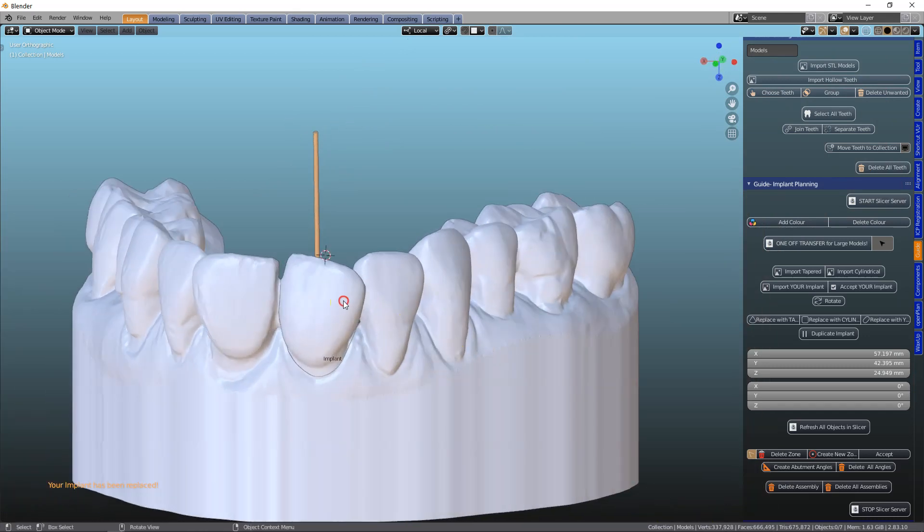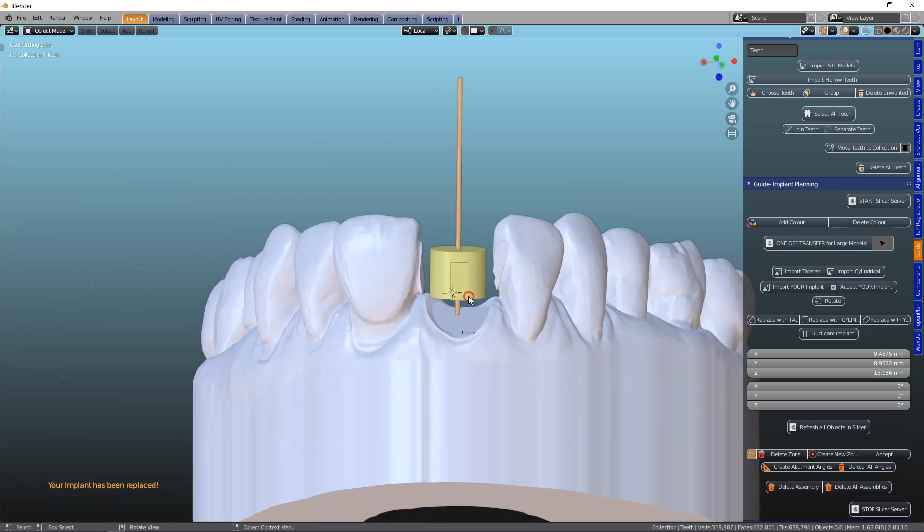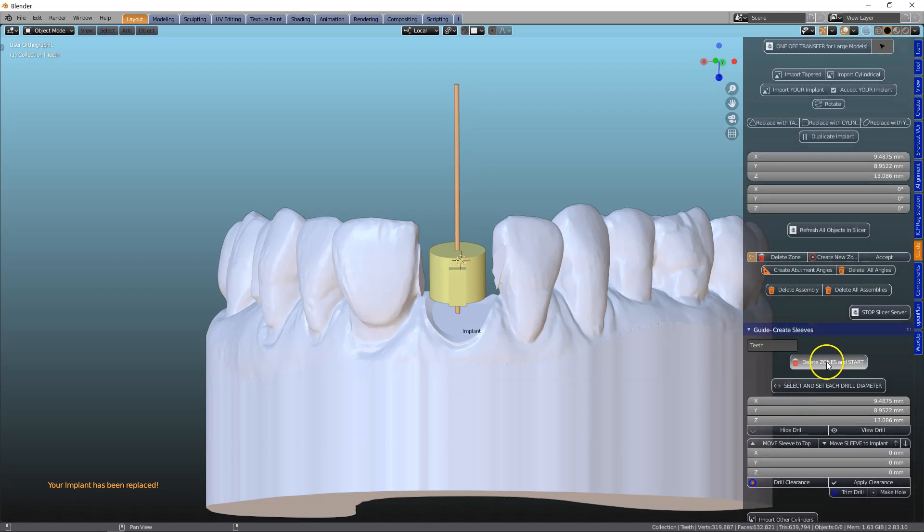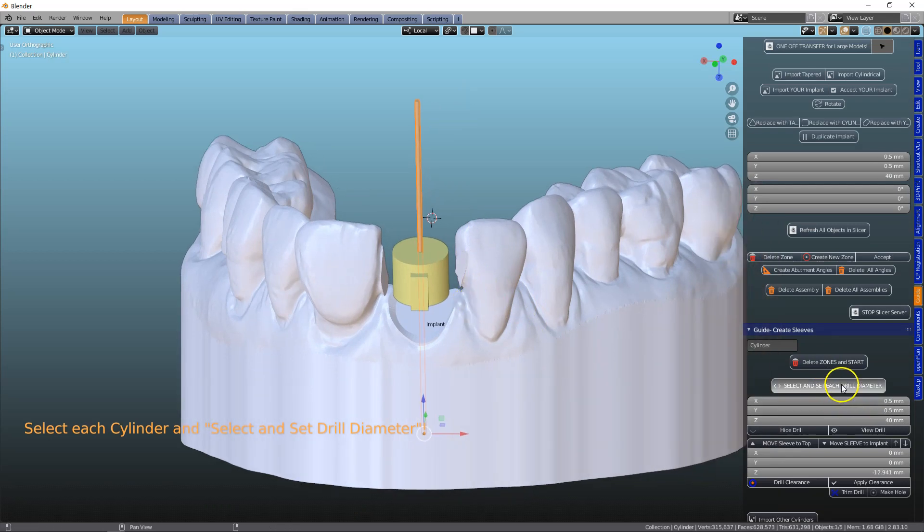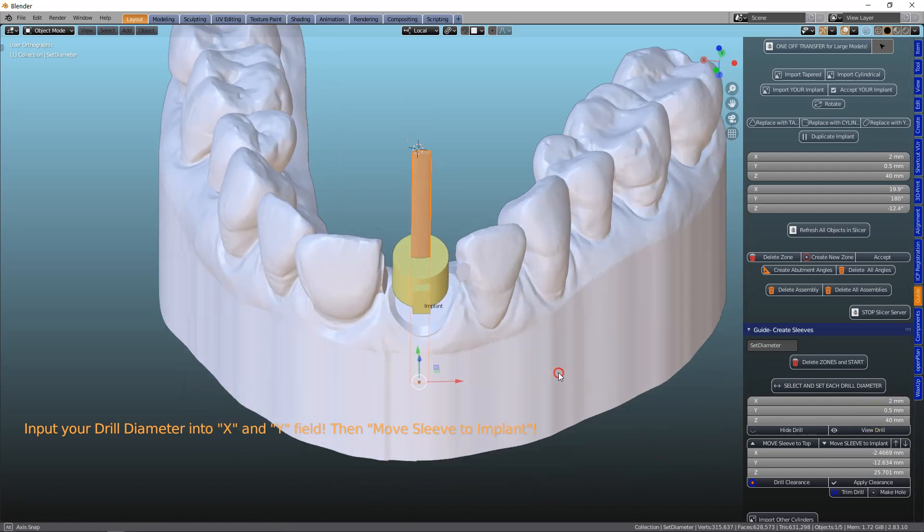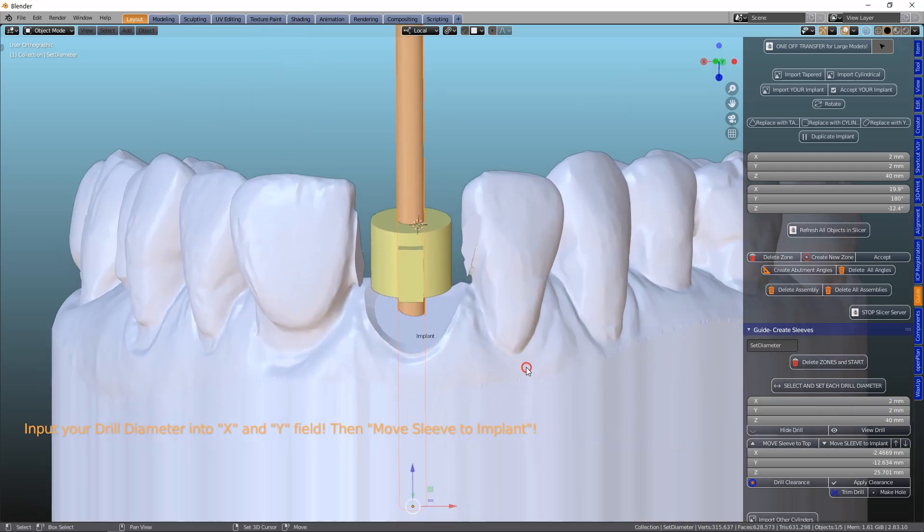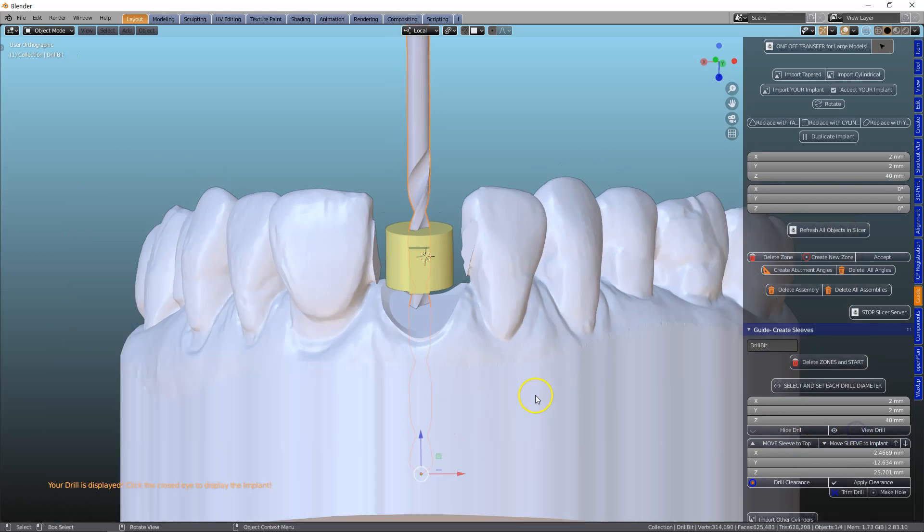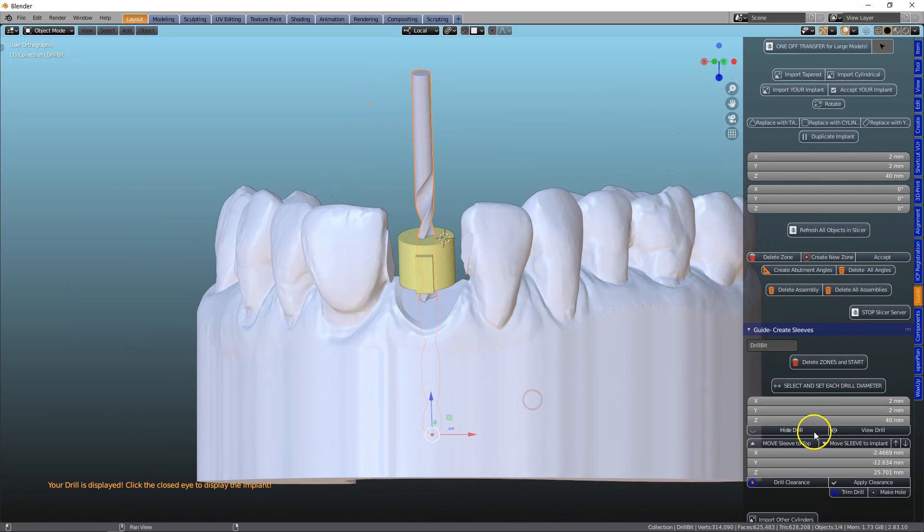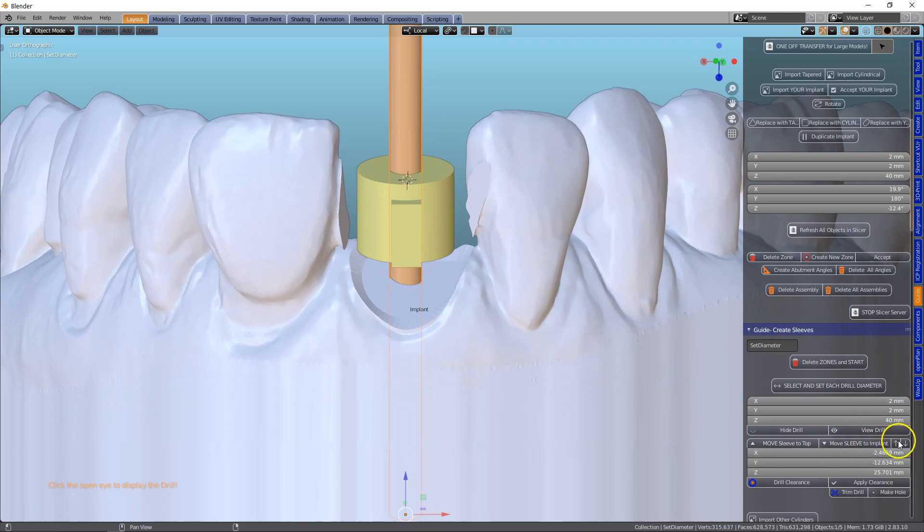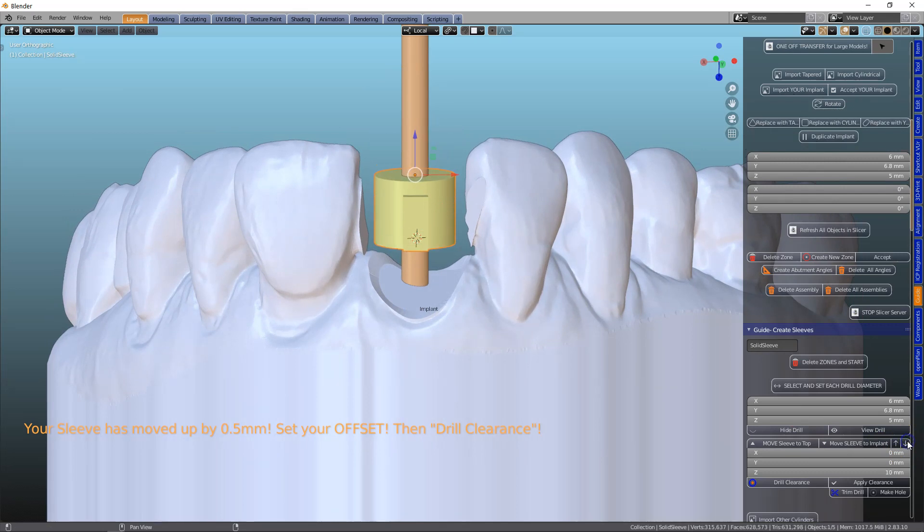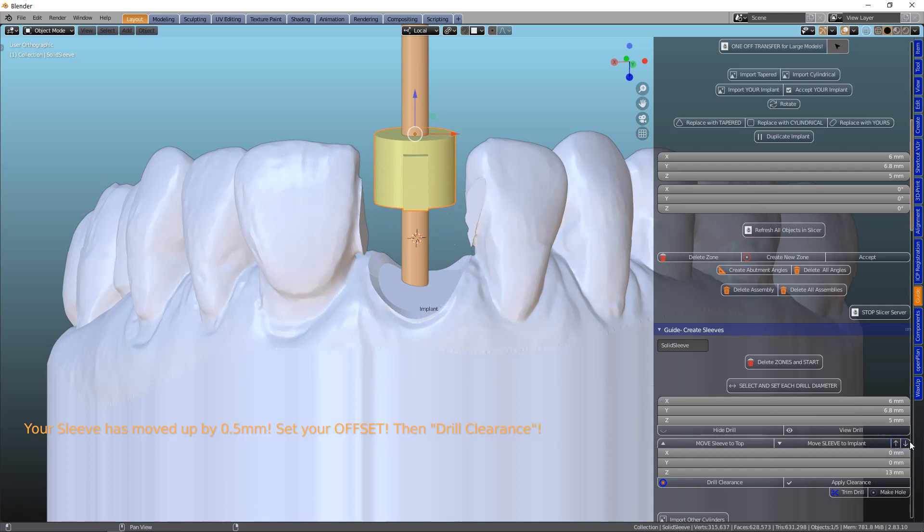Next of course we want to make a sleeve. So we're going to go into the guide module, delete the zones and then we're going to start. Let's set our drill diameter. So hypothetically we're going to set it, and then we're going to select our offset. We can view the drill if we want to. It goes through over there like this. Or we can set our offset up or down. So let's set this to 9mm. So this works in increments, as you can see, up by 0.5mm up or down.